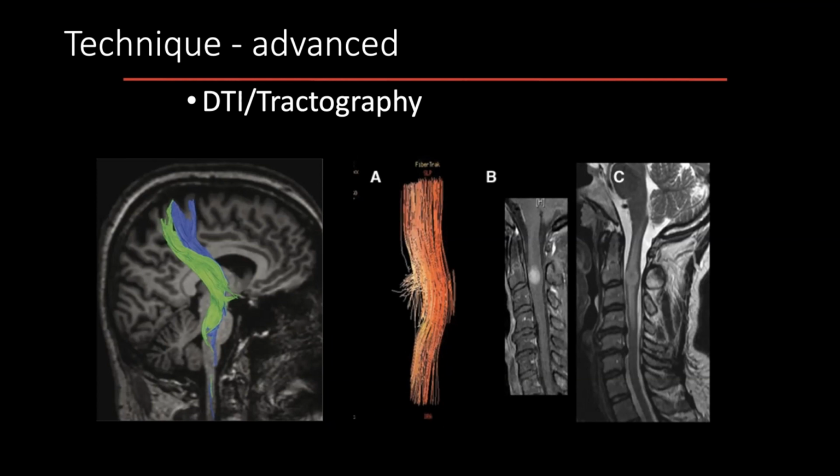Hi, so I have seen DTI used for two things: for traumatic brain injury, and I've also seen it for tumors in the brain. Yes, absolutely. Interaction with white matter. Yes, sorry, the question may be confusing you guys because the slide says DTI. DTI stands for diffusion tensor imaging.